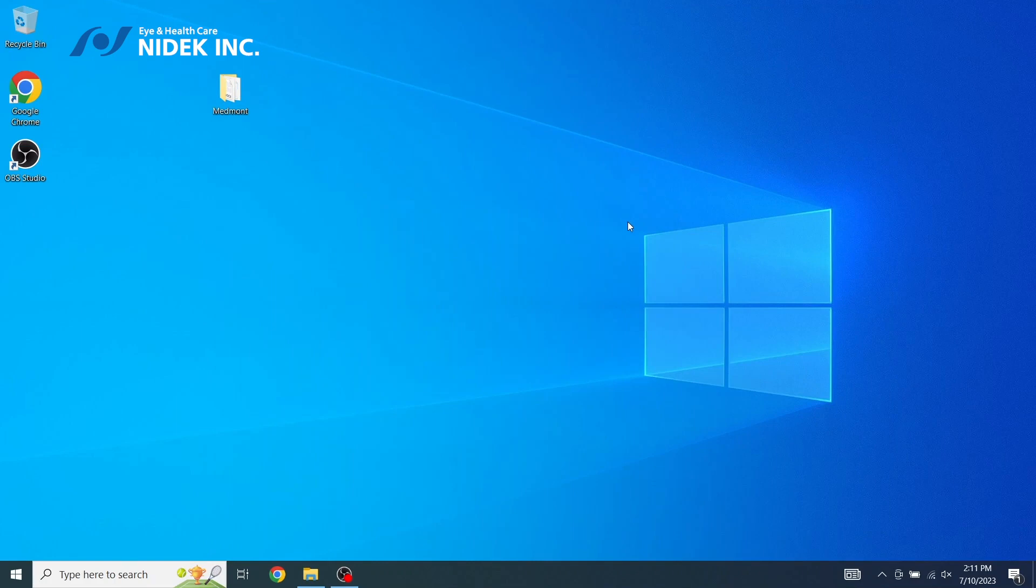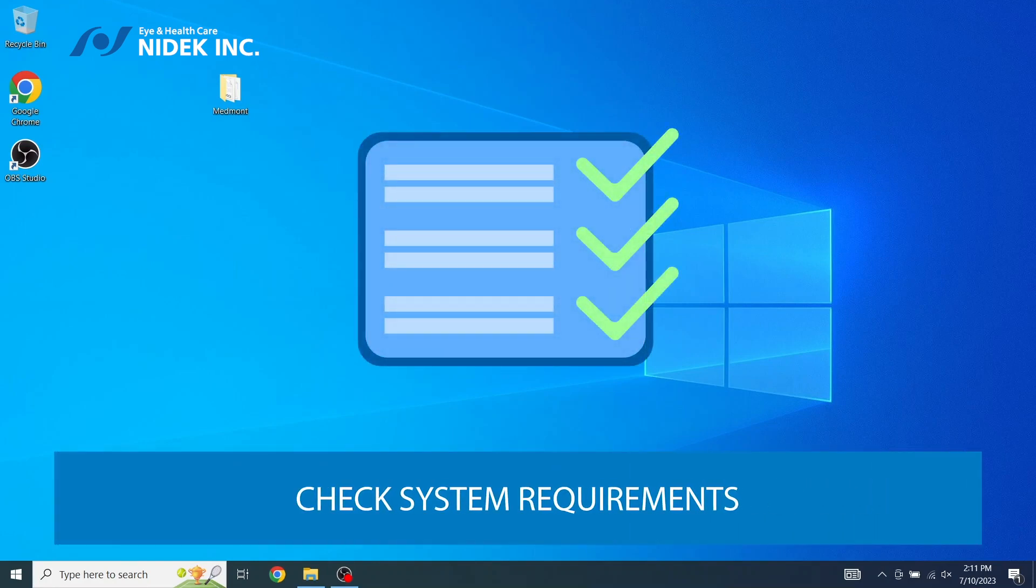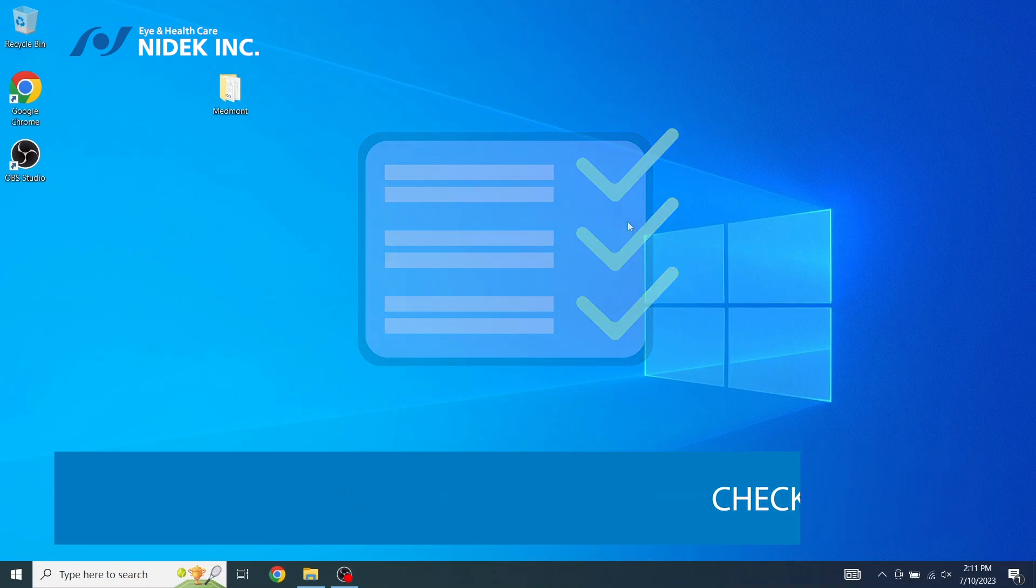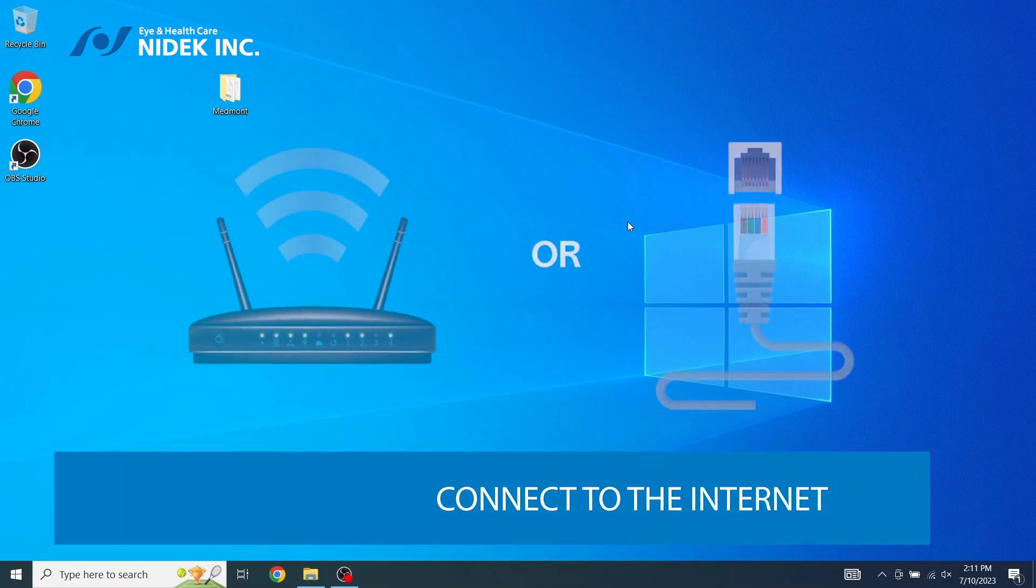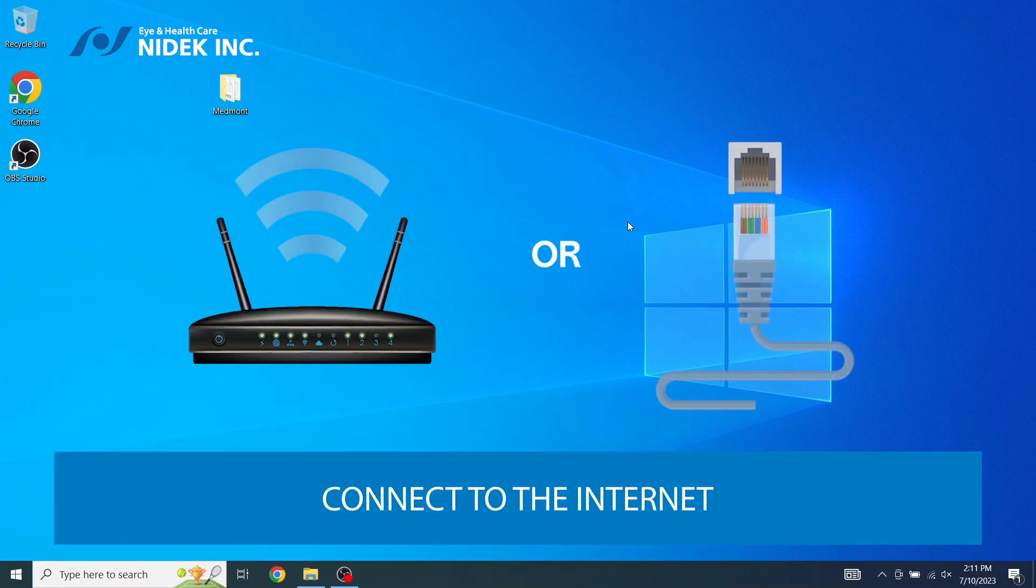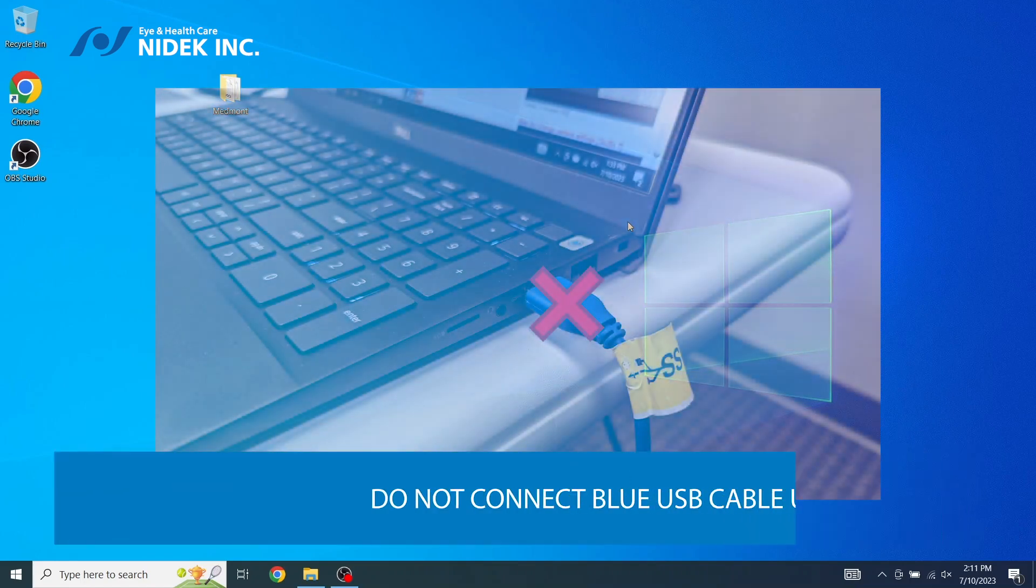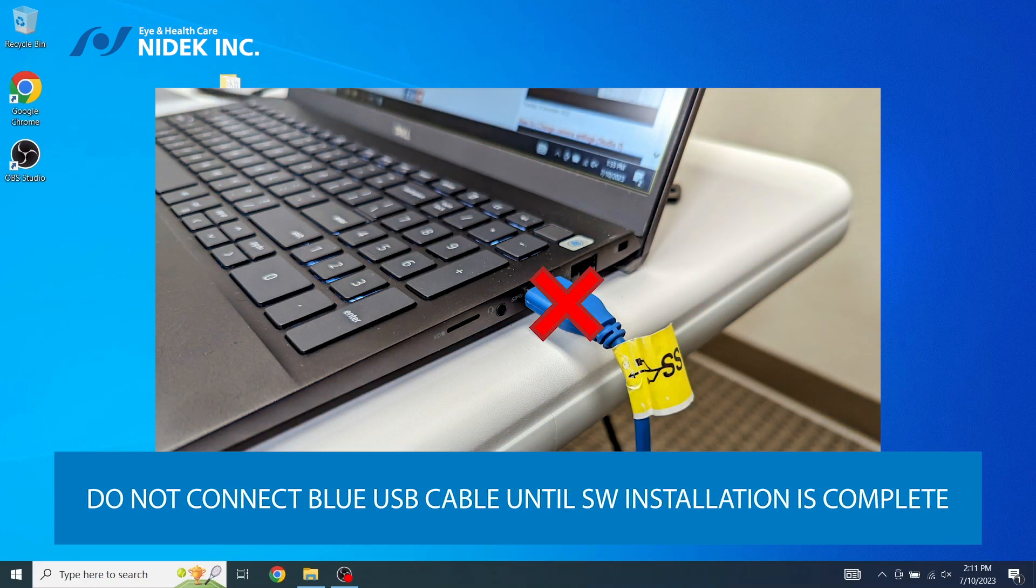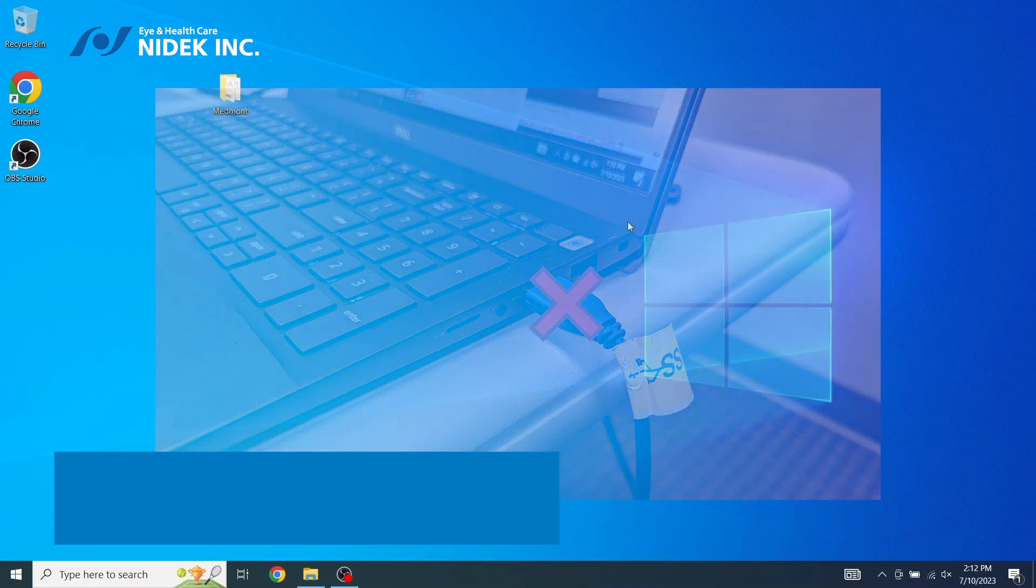Now I'm going to provide instruction how to install Medmont Studio 7. Please make sure that you check your computer meets or exceeds the basic requirement to run Medmont Studio 7. Please make sure that your computer is connected to the internet via wireless connection or LAN. Do not insert the blue USB cable into the PC until after the software installation.